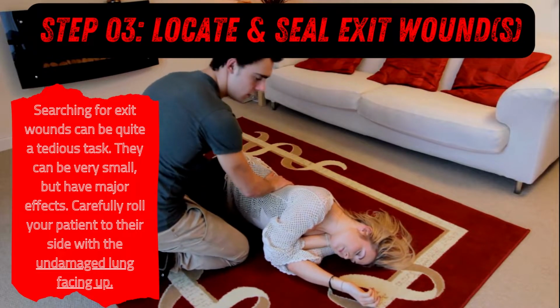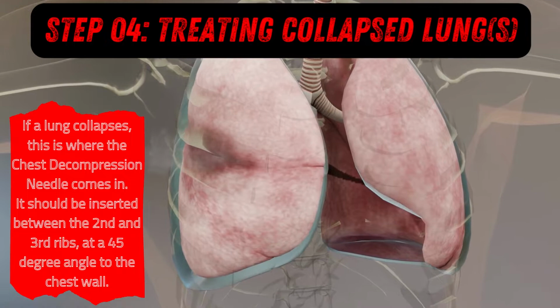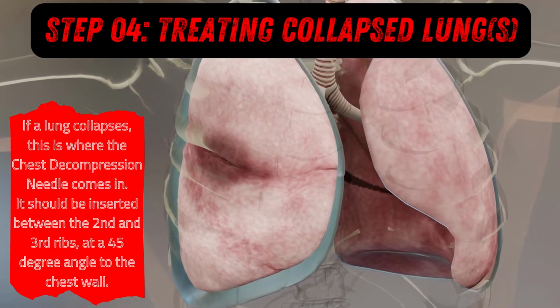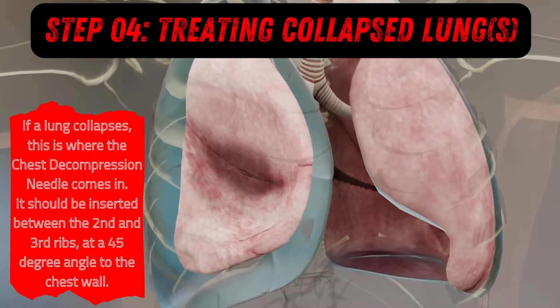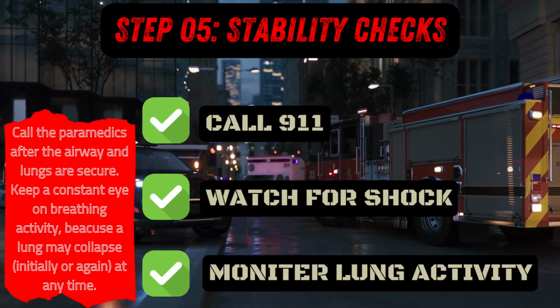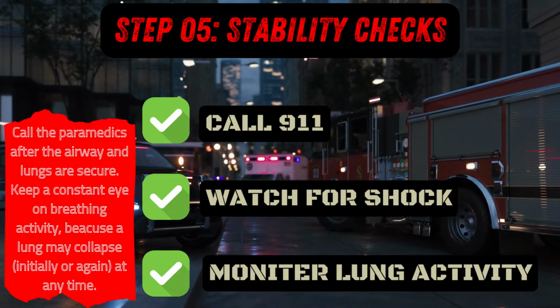To treat a collapsed lung, the chest decompression needle should be inserted between the second and third ribs at a 45-degree angle to the chest wall. Once you tape the needle container to the patient, the last thing to do is call 911, watch for signs of shock, and monitor lung activity until help arrives.